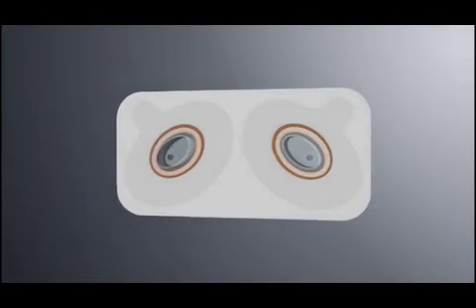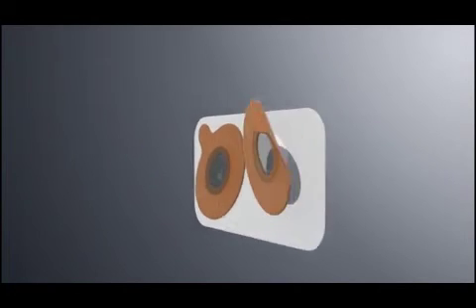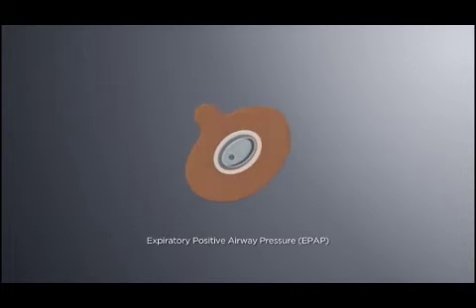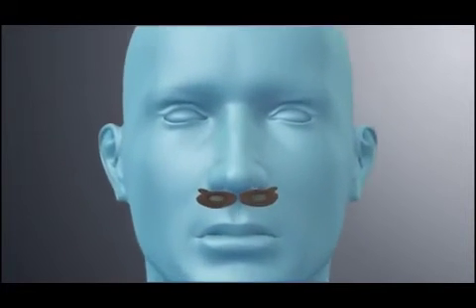Introducing ProVent therapy for obstructive sleep apnea. ProVent therapy is an innovative new treatment for obstructive sleep apnea that utilizes nasal expiratory positive airway pressure, or EPAP. ProVent therapy is a disposable device that attaches with a hypoallergenic adhesive over the nostrils.